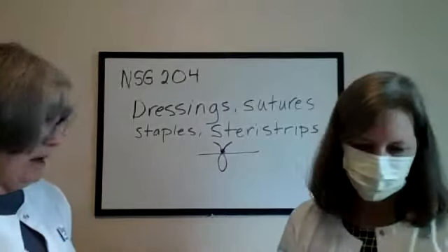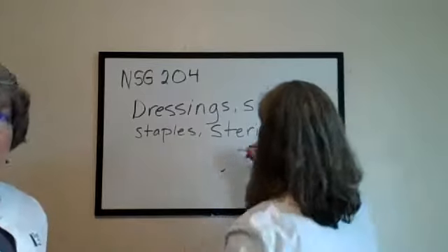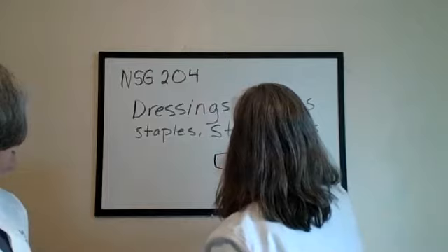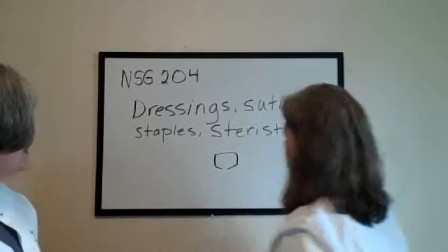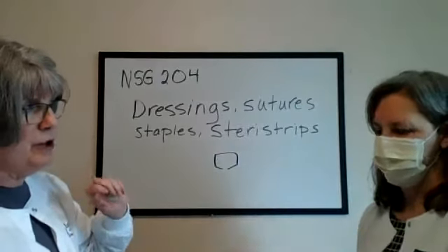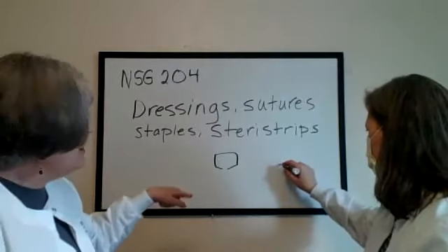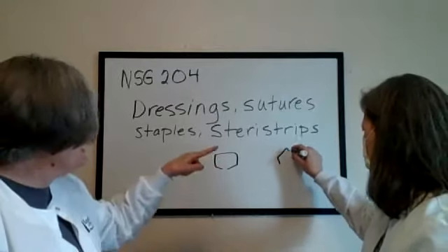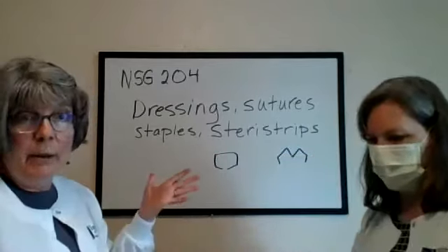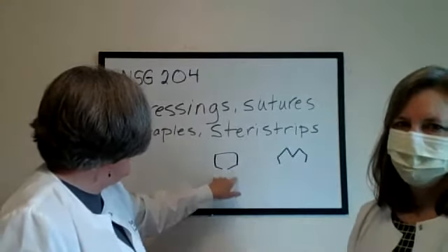It's literally, when you look at the staple, it looks like a real staple, like what you see. So when the doctor uses the staple gun and puts in the staple, it looks like regularly what a staple looks like in a paper stapler, honestly. These prongs right here are open, they hang down.